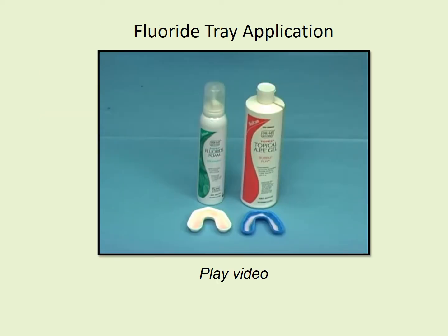This video will demonstrate the tray application of topical fluoride on a patient. The use of fluoride provides the most effective method for dental caries prevention and control. Fluoride treatments are not limited to use on children. Many adults with a high caries rate or root exposure can also benefit from professional fluoride application.